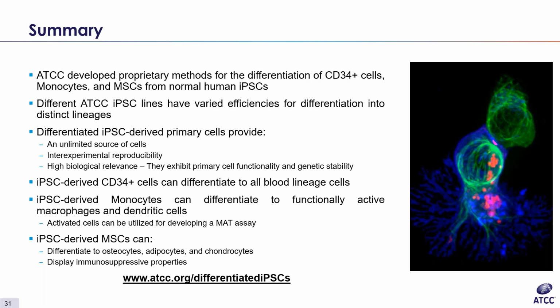Okay, we have another one here on the longevity of ACS-710 iPSC mesenchymal stem cells. Oh, okay. So what they want to know is how many population doubling levels and passages can these cells go? So iPSC-derived MSCs can be proliferated up to 20 PDLs, or roughly equivalent to going 10 passages.